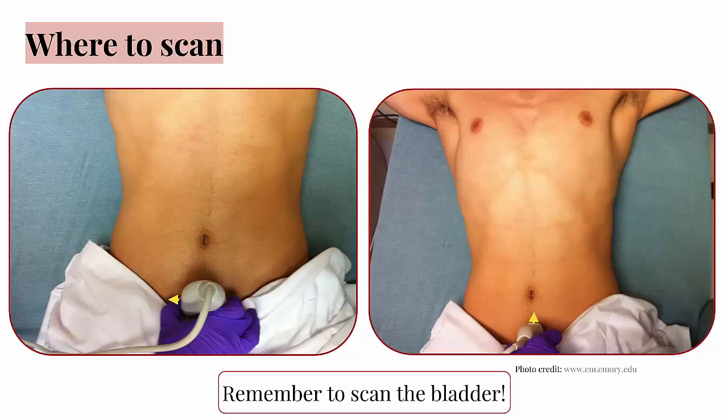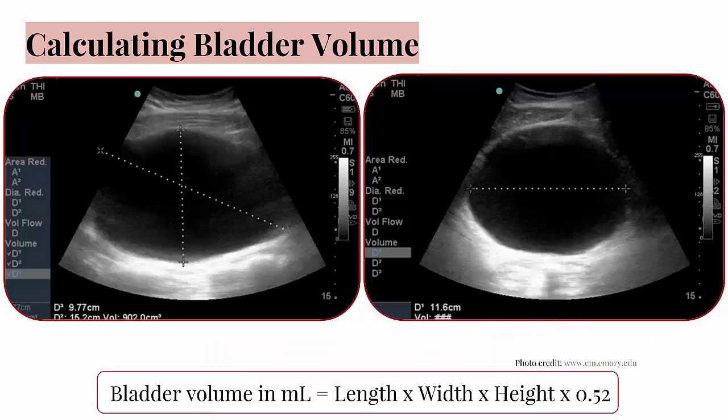Next, we're going to talk about scanning the bladder, which should be part of every renal exam. Again, we're going to be using that low-frequency curvilinear probe to scan through the transverse and sagittal plane, fanning through the entire bladder to obtain an estimated bladder volume and evaluate for any masses, stones, distension, etc. So when we talk about measuring the bladder volume, there are a few different methods, but the most widely accepted is the prolate ellipsoid equation, which states that bladder volume in milliliters equals length times width times height times 0.52.